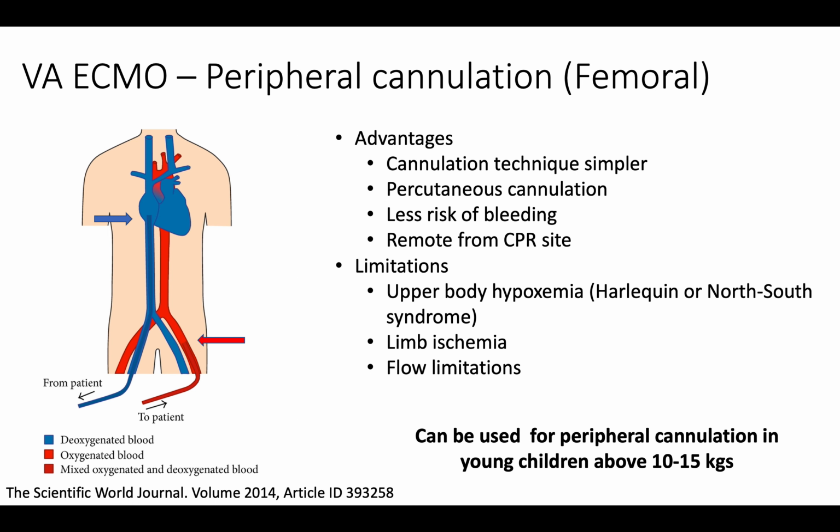Another disadvantage is that the option of direct LA venting is not there. If there is LV distension leading to pulmonary edema, the left side has to be decompressed by other techniques such as septostomy.